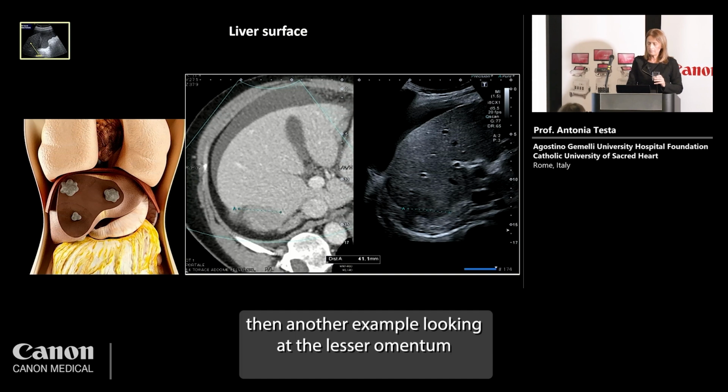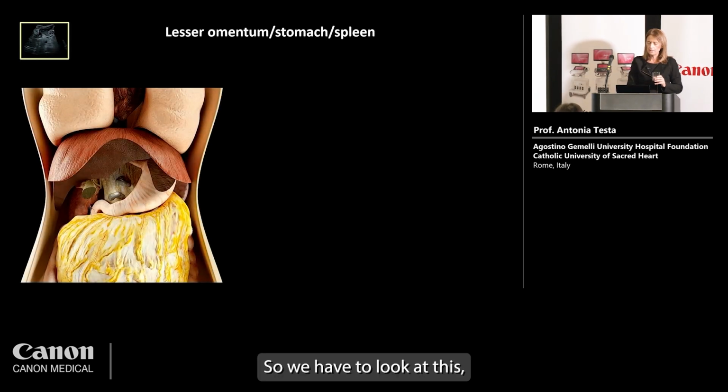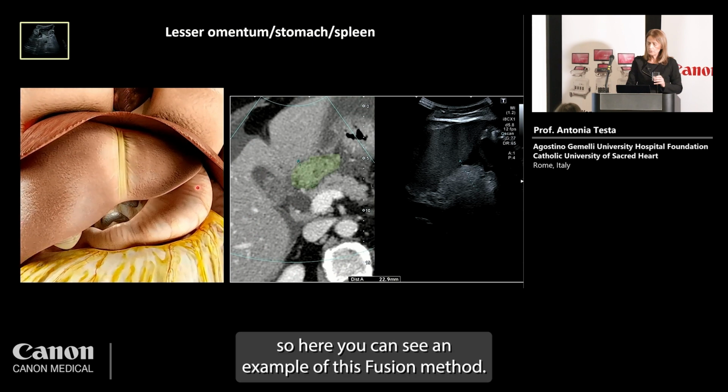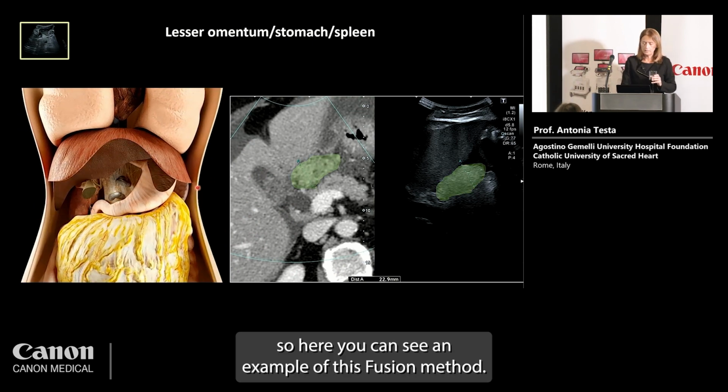Then another example, looking at the lesser omentum. So we have to look at this. I need my laser. So here. And even during surgery, it's not easy to assess this area. So here you can see an example of this fusion method.